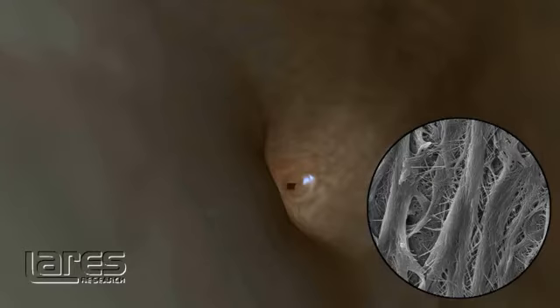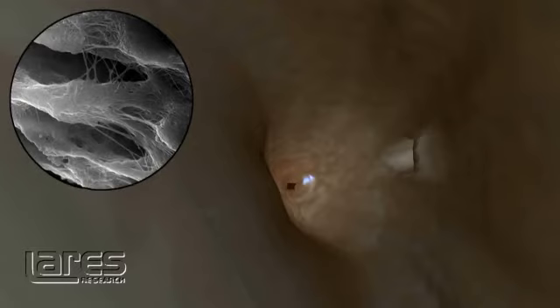surfaces uniquely intact. In fact, due to the non-ablative and remote, distant from the apex, mechanism of action with the PIPS laser protocol, our SEM microscopy has demonstrated both hydroxyapatite and even collagen fibers to remain intact and undisturbed morphologically. Traveling further down the canals, we see evidence of lateral canals that are well cleansed and void of tissue and smear layer. The remaining canal preparations show efficacious removal of debris from the entire canal system.